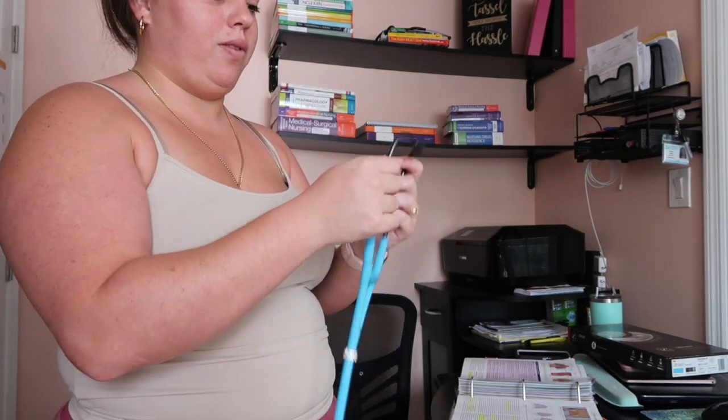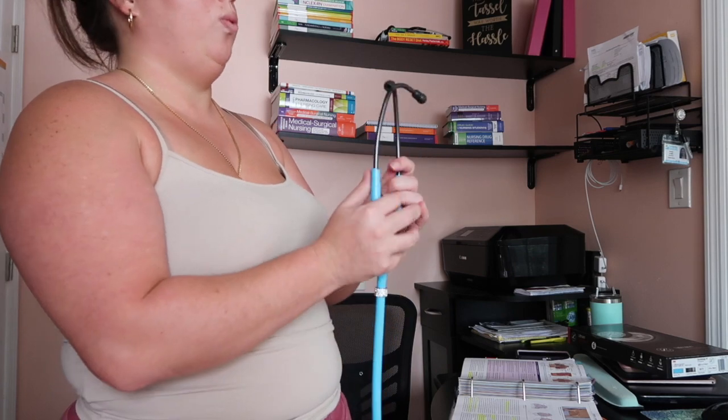Whenever you use your stethoscope, you want to make sure the earpieces are facing frontwards — pointing away from your body — or else you're not going to hear anything and it's going to be quite uncomfortable. Make sure it's pointing away, kind of like a little V pointing away from you, then put them in your ears and let them get snug.